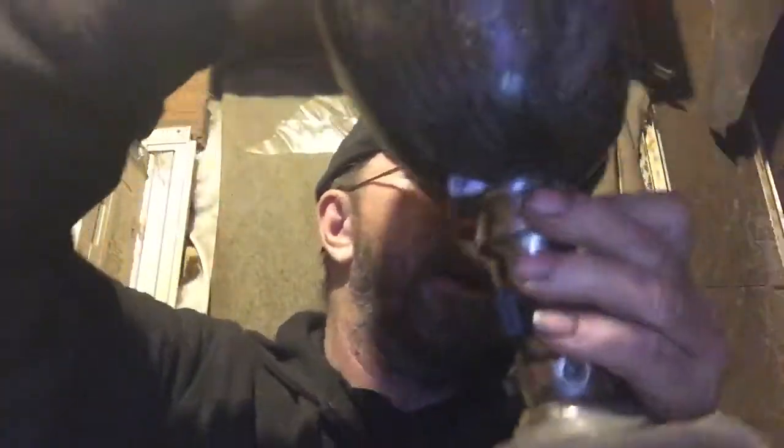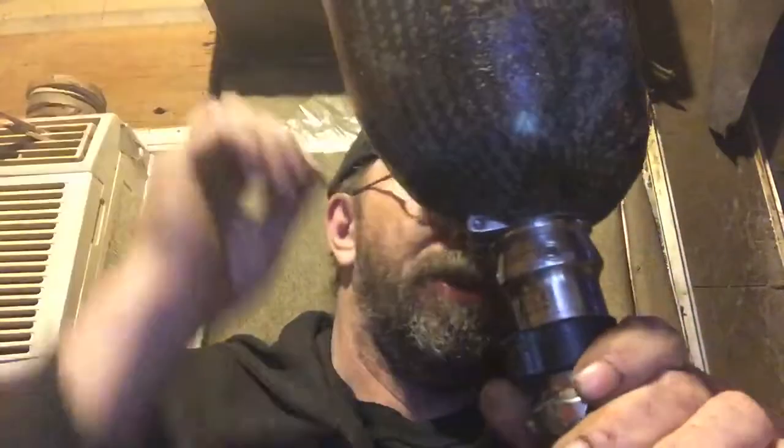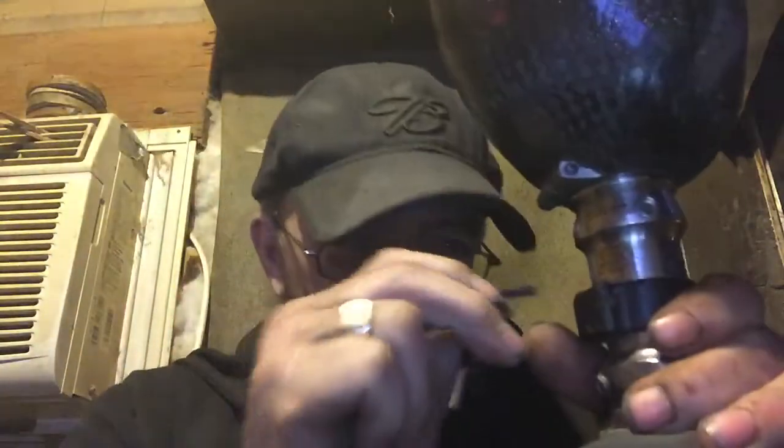Another thing you want to do — and you only need a cheap set of dollar store ones — is an Allen key. Periodically go around and make sure none of those bolts are loose, because you can have one that's extremely loose and still won't feel it if the other three are really snugged up. Just take your Allen key, go around, and check those out.